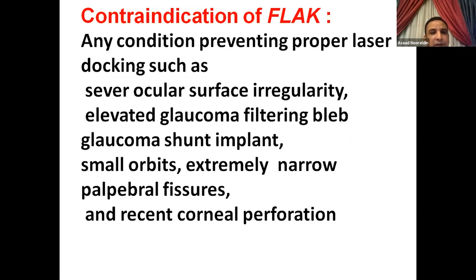Is there a contraindication to femtosecond laser? Yes, there is. Any condition which prevents proper docking, such as severe ocular surface irregularity, elevated glaucoma filtering bleb, glaucoma shunt implant, small orbits, extremely narrow palpebral fissures, or recent corneal perforation. All these prevent proper docking.